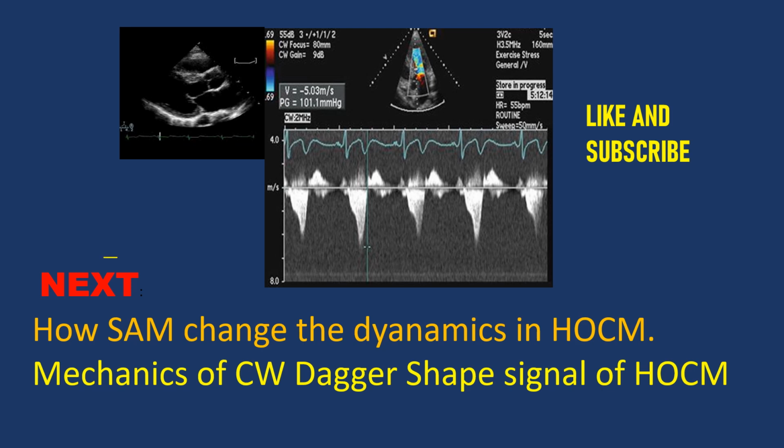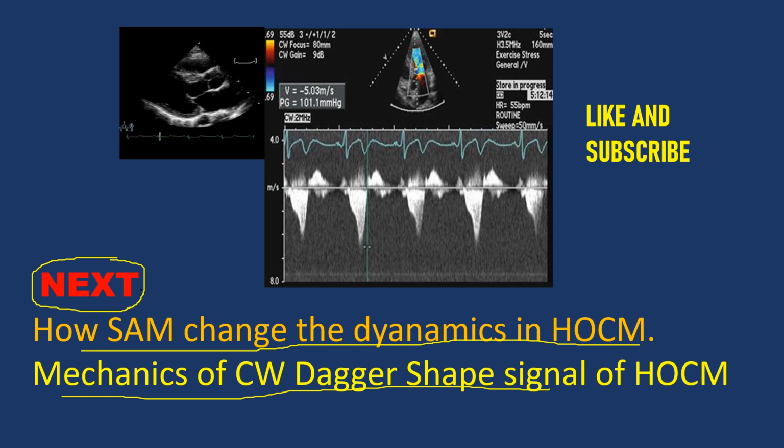Thank you friends, you must have liked it, and next we are coming with the SAM, how it changes the dynamics in HOCM, and the mechanics of the continuous Doppler signal of HOCM.